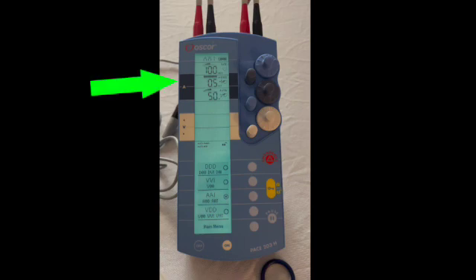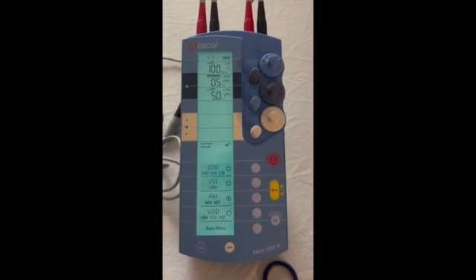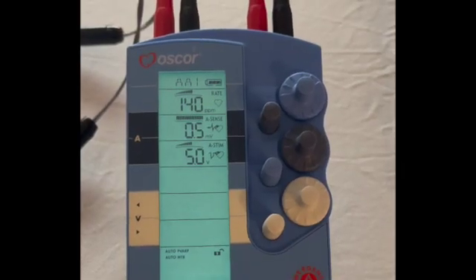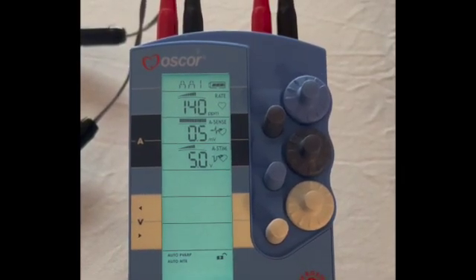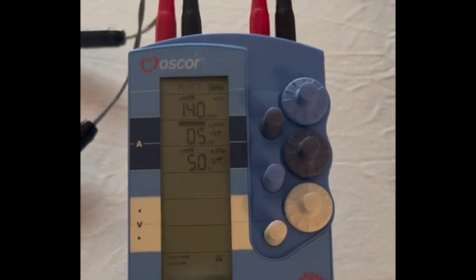Let's talk about these little lights on the side. The sensing light flashes when the pacemaker sees native cardiac electrical activity and inhibits itself. The light next to stim flashes when the pacemaker paces. This can be helpful when trying to troubleshoot pacemaker problems.